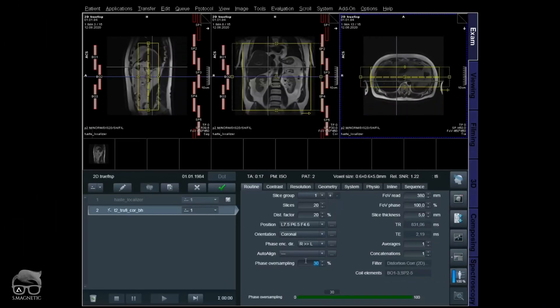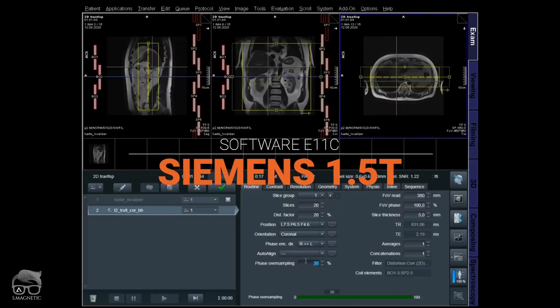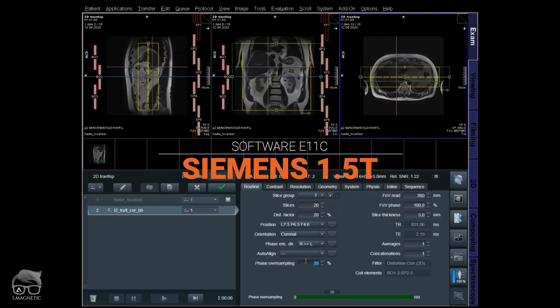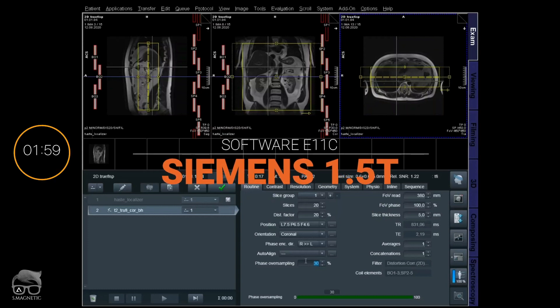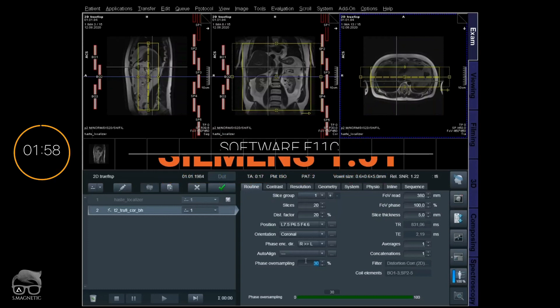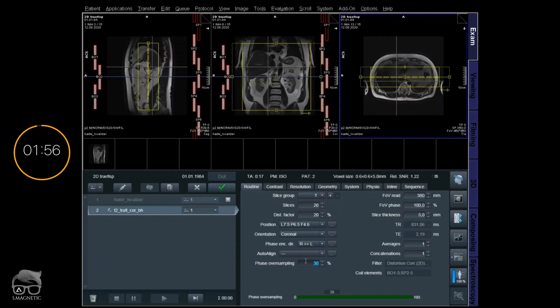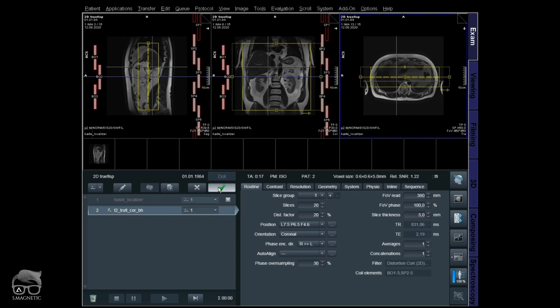Let's go to the scanner. We are live at the 1.5 Tesla — let the countdown of two minutes begin. In front of you I have a localizer and a 2D TrueFISP coronal with a few slices over the liver, just to see the banding artifact. So what we do here now is apply for this one.